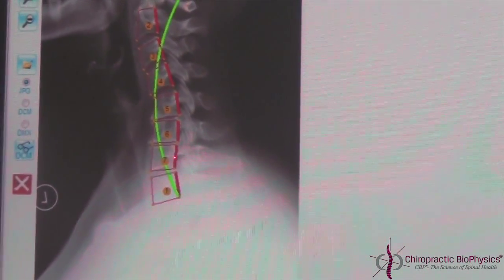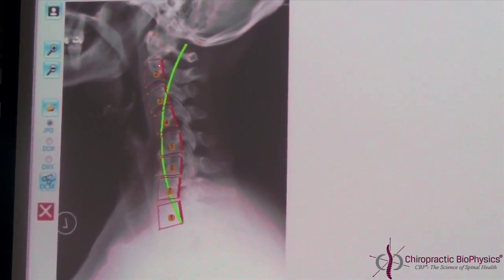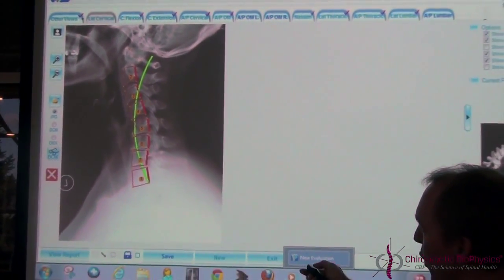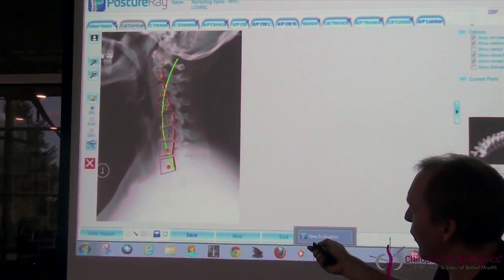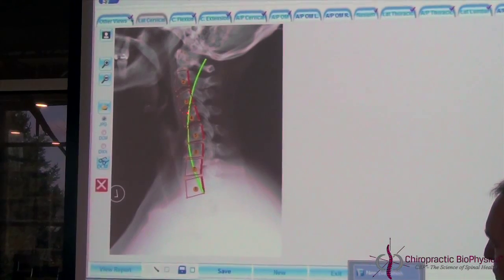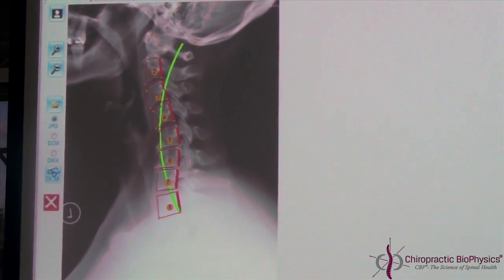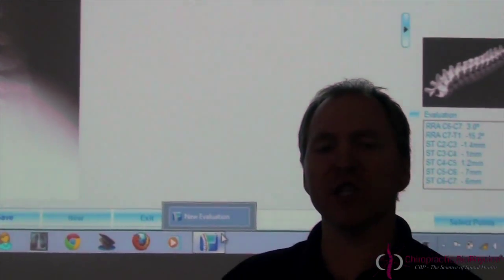What we do is put a line on the back of the vertebral body, and that's how we compare the patient's lateral alignment in the sagittal plane relative to our idealized model. The idealized model is a green piece of a circle in the cervical spine — or a shade of gray if you don't see color. The broken dashed line on the back of each vertebral body is a red line.